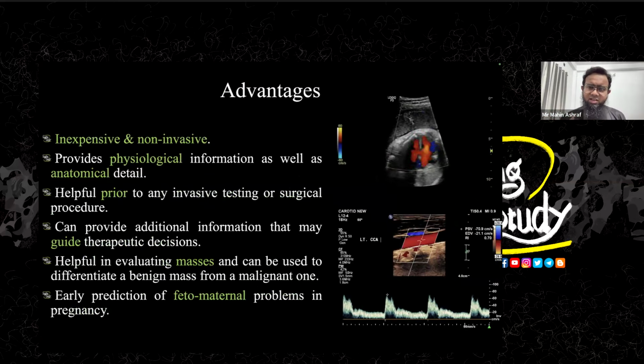Now, the main advantages are that it is inexpensive and non-invasive. If you want to see the blood vessels of a patient, you have to go with a CT angiogram, cath angiogram, MR angiogram, or anything. But these are expensive and invasive procedures, and you cannot repeat them every day. Color Doppler is quite safe and non-invasive, and in comparison to other imaging modalities, it's quite inexpensive. So you can repeat it whenever you need. That is the real benefit of Doppler. And you are assessing the patient in real time. You can do it at the bedside.